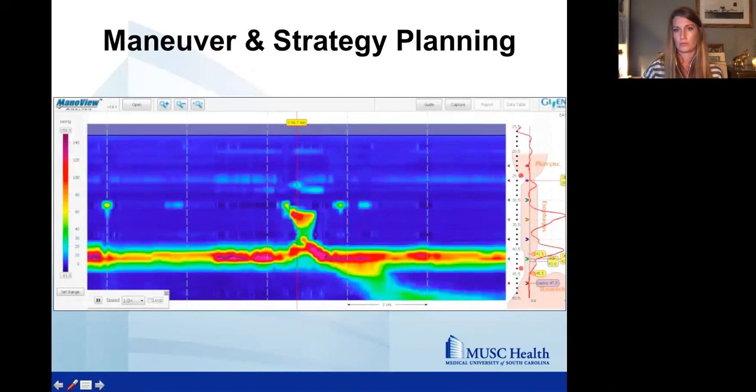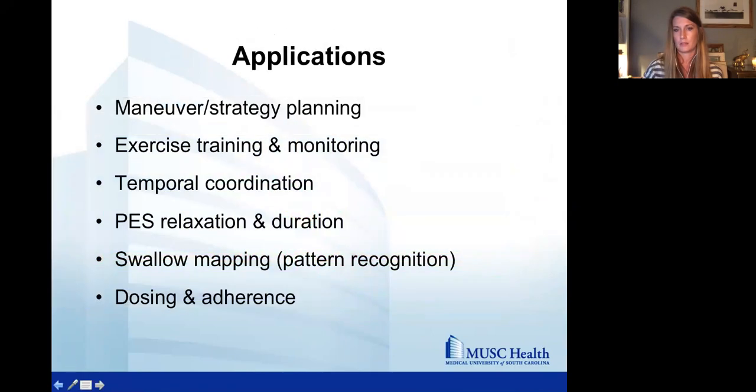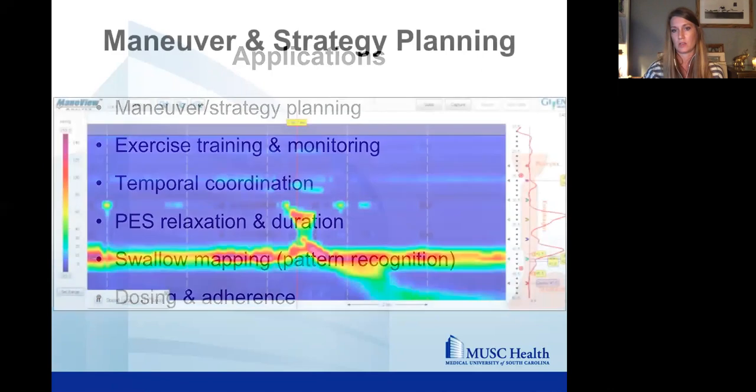So let me jump back. I want to talk about the different applications that you can use in therapy, because it's not a one-stop shop or one-fits-all type deal. Just like we target or individualize our therapy for swallowing based on swallowing physiology and what we're seeing on modified barium swallow study or with our HRM diagnoses, we have different applications that we can use, and you see them listed here. I'm going to go through each one, keeping in mind that each plan is individualized for the patient.